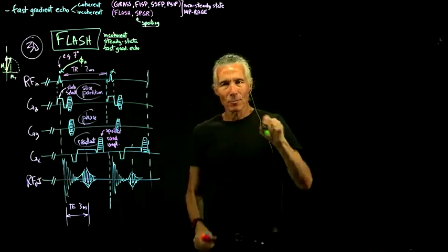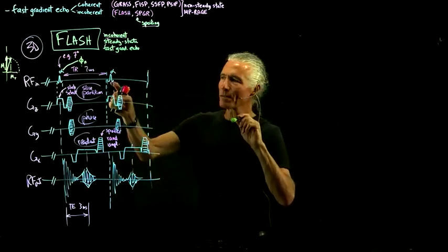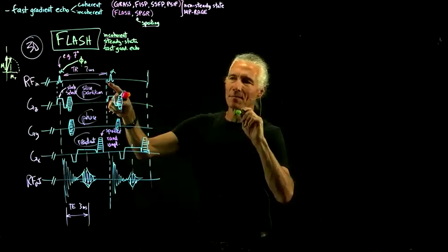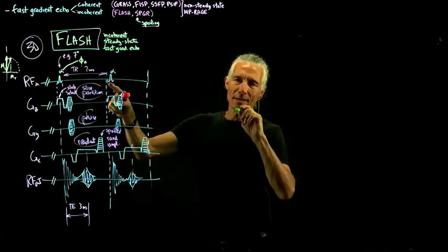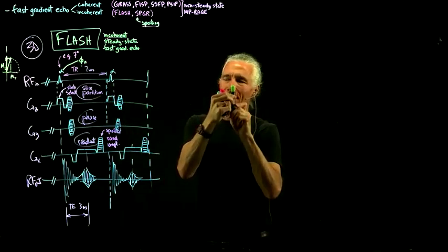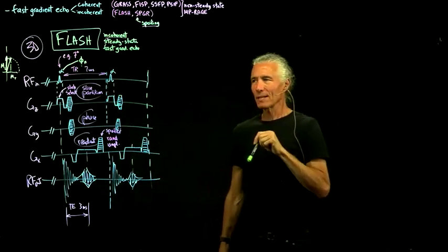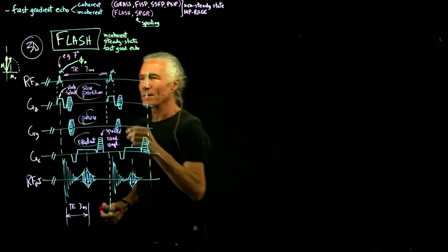And then the transmitter keeps really good time, and so what you can say is, well, I'm going to turn on this RF pulse with a phase of 90 degrees. And what does that mean? That means that I'm going to turn it on a quarter cycle ahead of where I turned it on the first time when I defined t equals 0. So that's what the phase means.